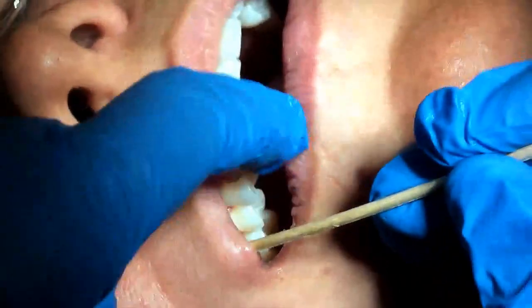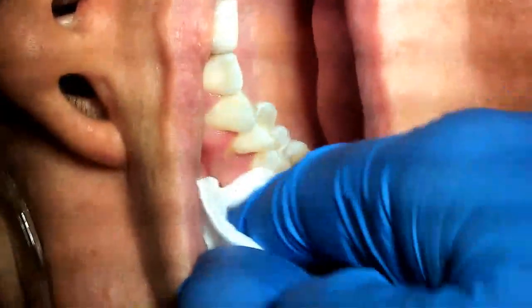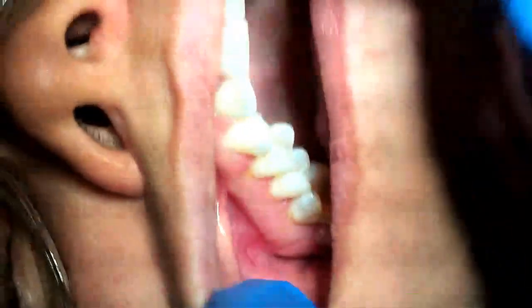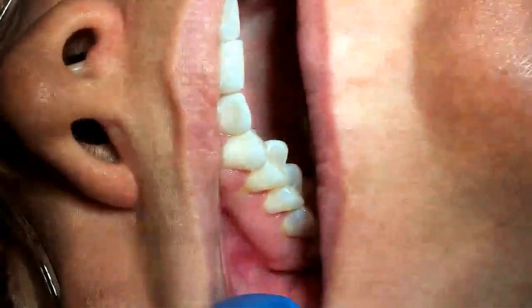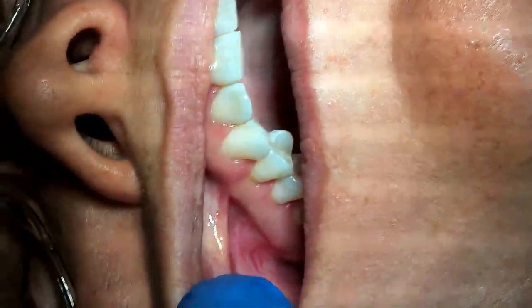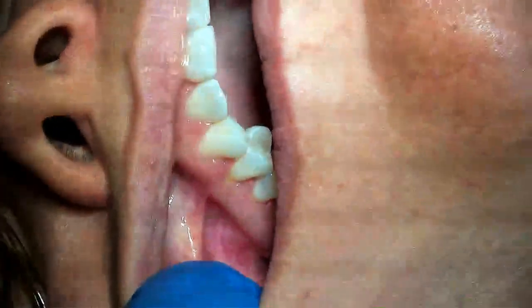I'm going to remove my topical and dab any excess off, or you can rinse it off with some water and rinse the area. The site looks good, so now we're going to go ahead and give our injection.